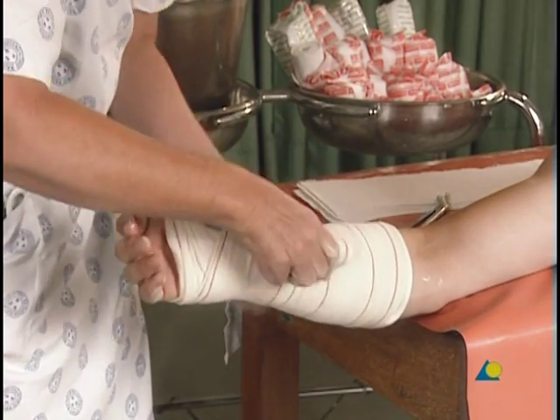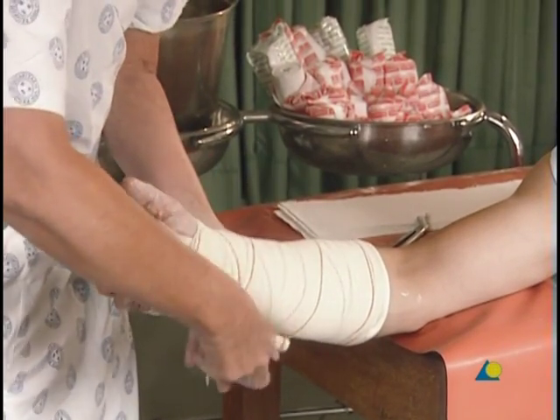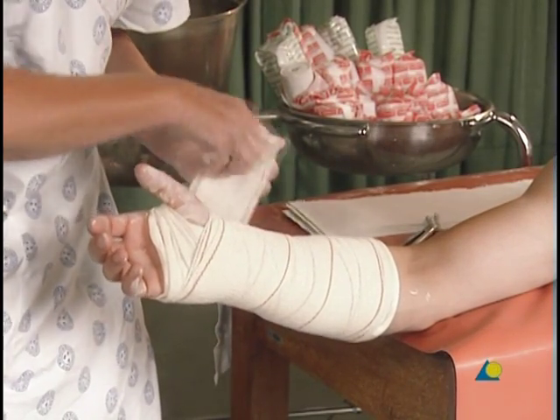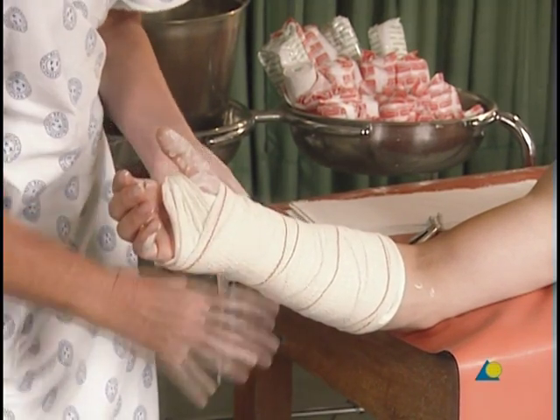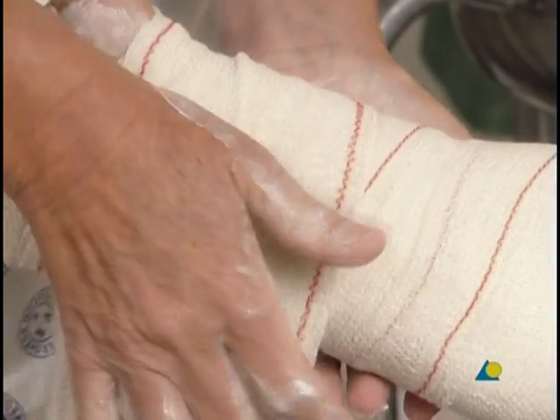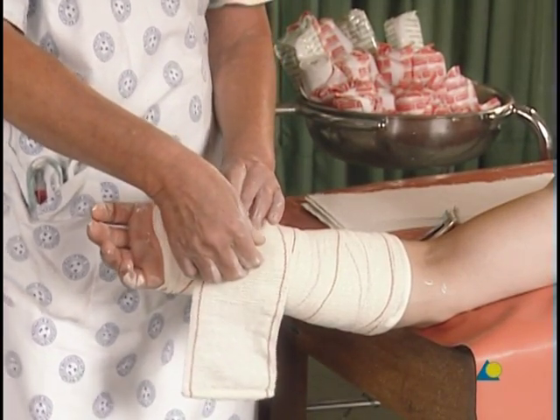It should be noted that the plaster is still soft and can be molded. The plaster will not achieve full strength for 36 hours. The plaster is molded by applying pressure to the radius depending on the type of fracture. If flexion of the wrist is desired, it can be achieved now by molding.